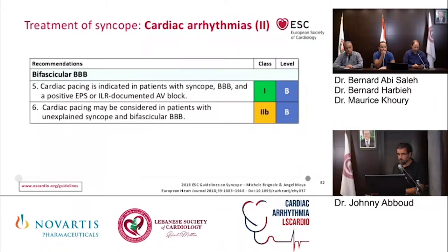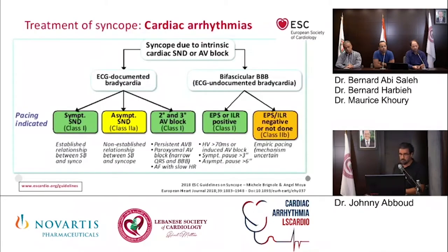In bifascicular block, cardiac pacing is indicated in patients with syncope and bifascicular block and a positive EP study or an implantable loop recorder documenting AV block. This is class 1. 2B, if you want to implant without doing investigations, like we said. So this is the summary of the indications.